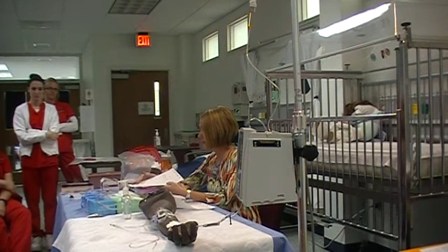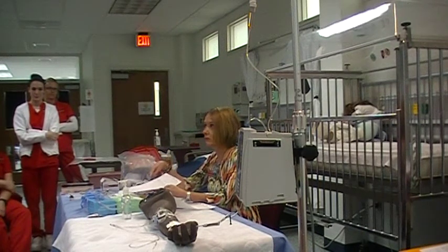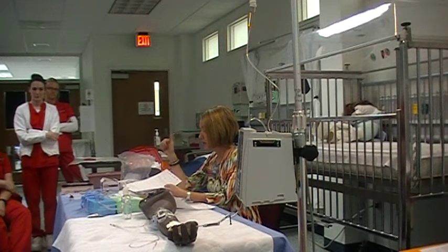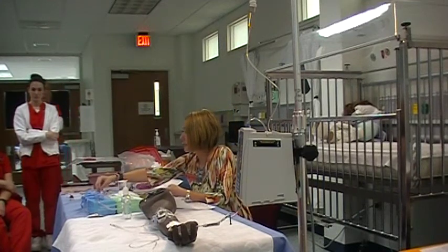We're going to verify the physician's orders. You're going to tell me the rights of the patient. Again, write down this list, guys. So patient, medication, dose, time, and the route. Then you're going to look at your medications. You're going to find Lasix on the table.